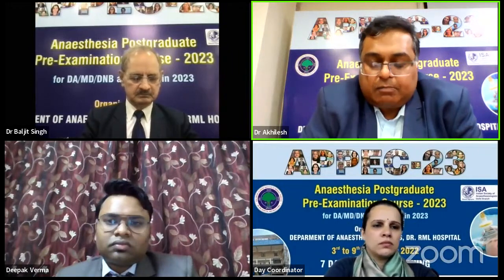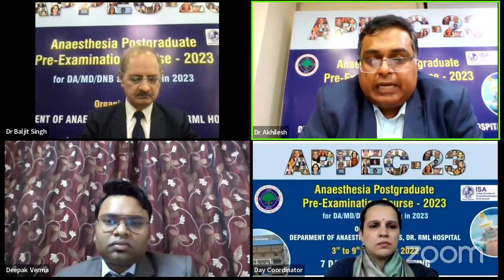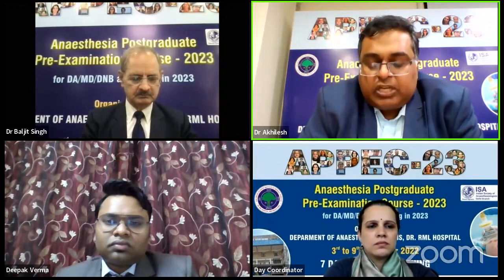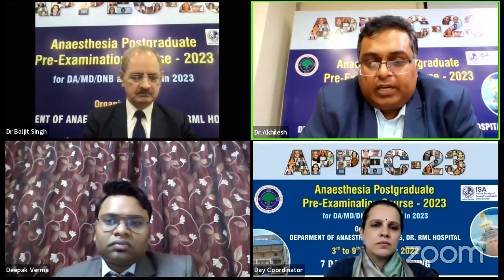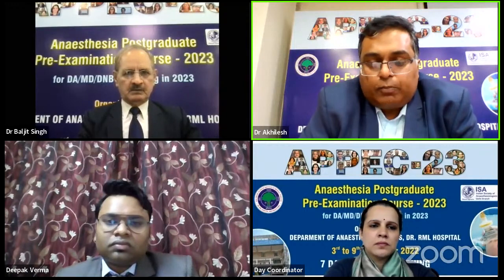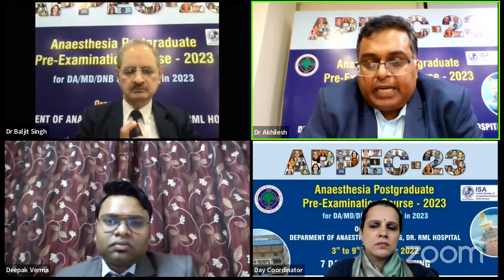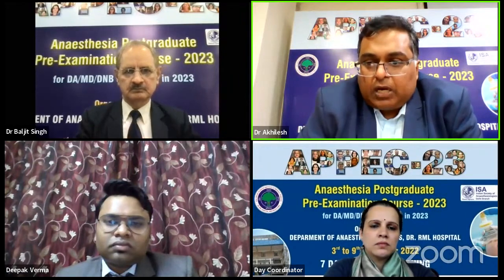Another is the Pethick test, which you should all know, and which is based on the Venturi principle: whenever you put the oxygen flush on, the bag collapses. Because of the Venturi principle, when you push the flush on, the gas goes at a high rate, a vacuum is created, and then the bag collapses.